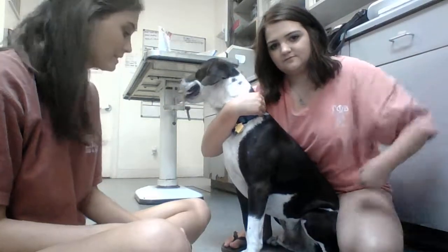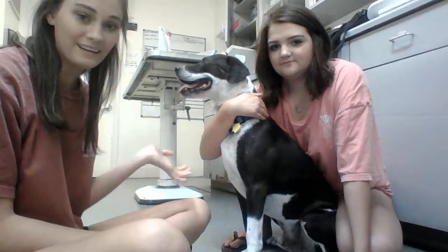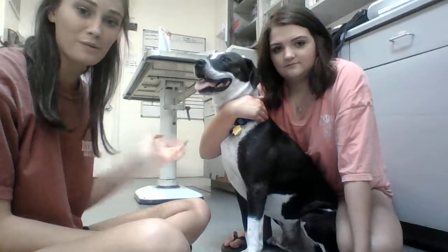Hey, my name is Cole and I'm going to be drawing blood from a cephalic vein. This is my dog Bullet and he will be the one I'm drawing on, and Caitlin will be my restrainer.